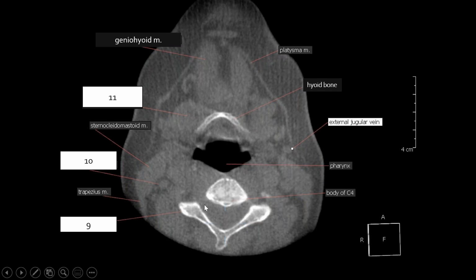This is the vertebral body. Out to the lateral aspect are the other portions of the spine. These are the facet joint regions on each side. So the spinous process is at the back, and this is towards the lateral process, and this is called the articular pillar. And this will be communicating with the joint above and or below.